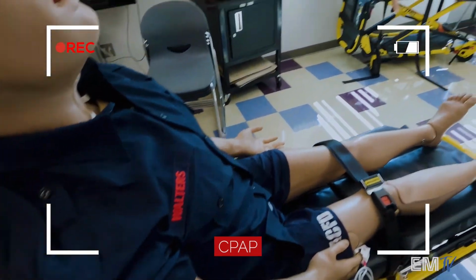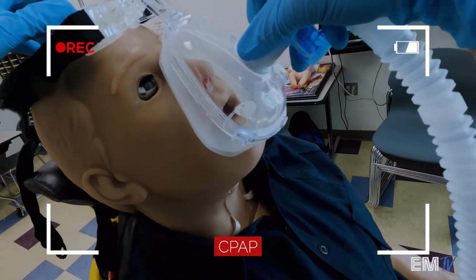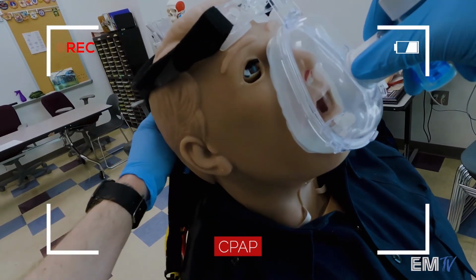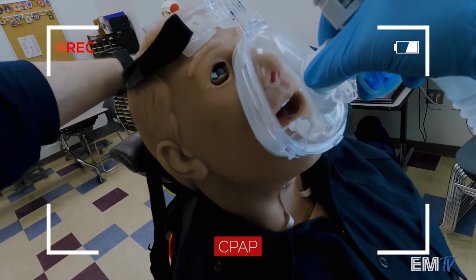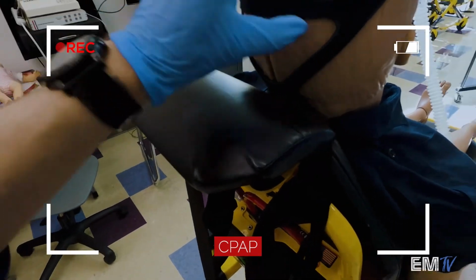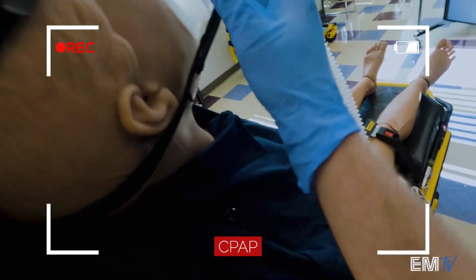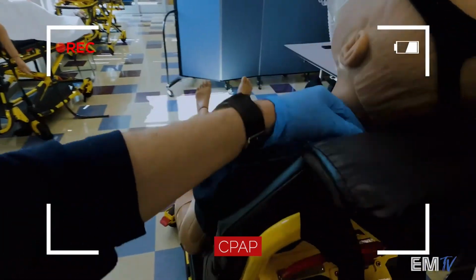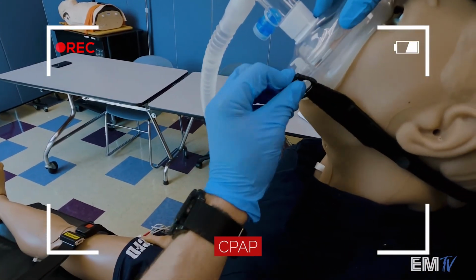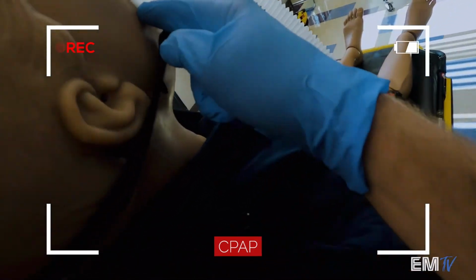As the top straps come pre-connected to the mask, I'll put the mask on the patient's face first, putting those straps up over the head while adjusting the forehead piece. It's helpful to have your partner or the patient hold the mask in place while you adjust the straps. The top set of straps will be velcroed in securely, the bottom straps attached to the side of the mask using clips. Once you have securely affixed these clips, check the tension at each strap to assure that there are no leaks around the outside of the mask.